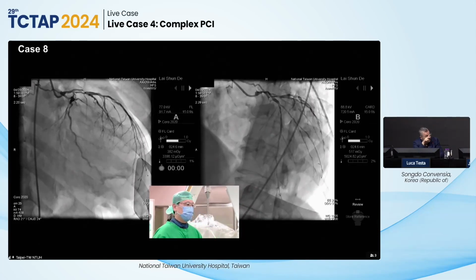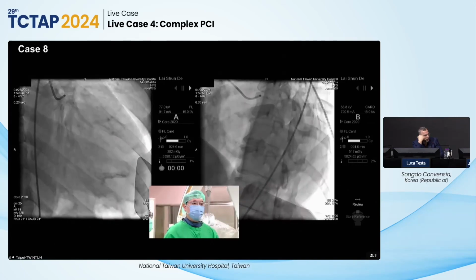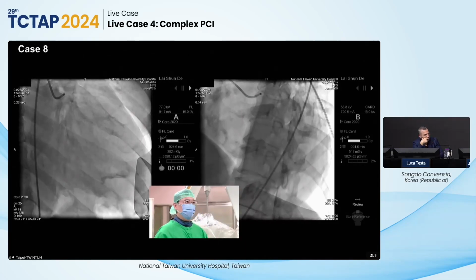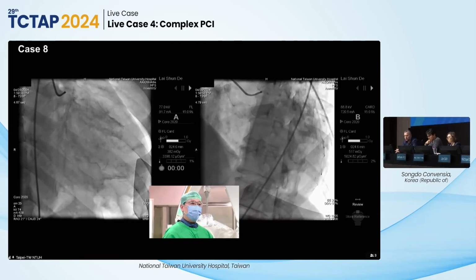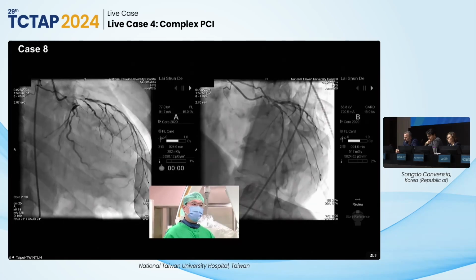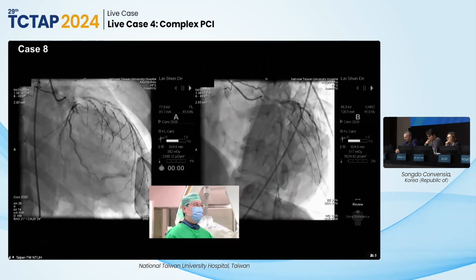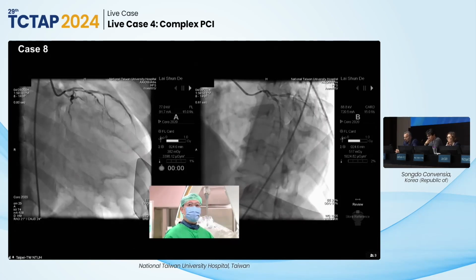With the IVAC, you need two accesses. Is there any specific reason about that? Okay. In Taiwan, Impella is available also, as well as the IVAC. And the patient has a good peripheral vessel. We had evaluated with the CT examination. And maybe as well, all the experts were really familiar with the Impella system, Impella CP. So this time we tried to try something new with you, and we selected IVAC this time.